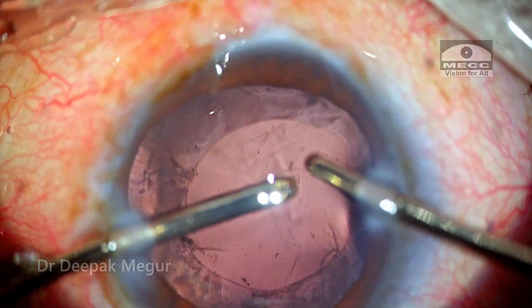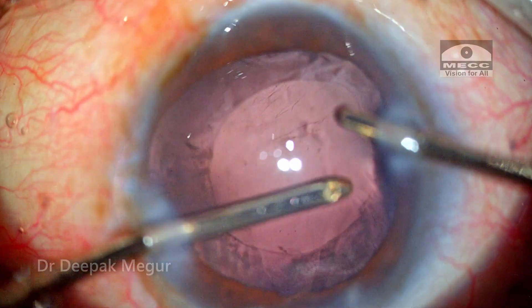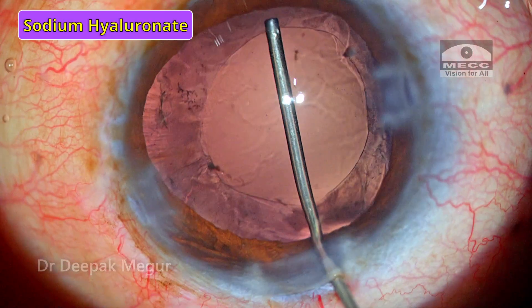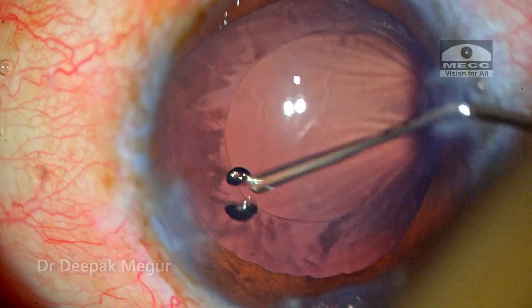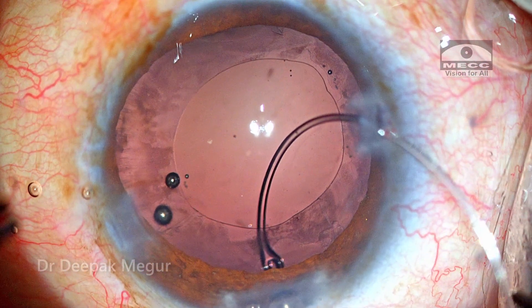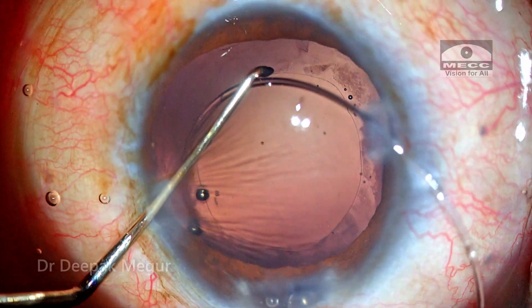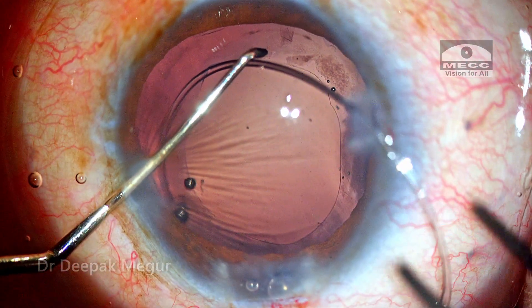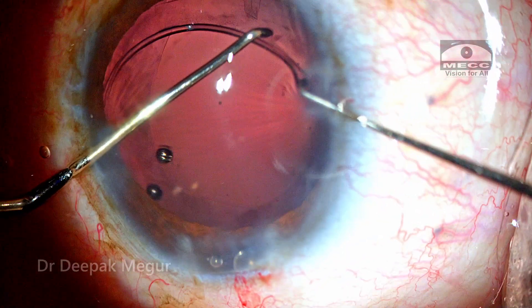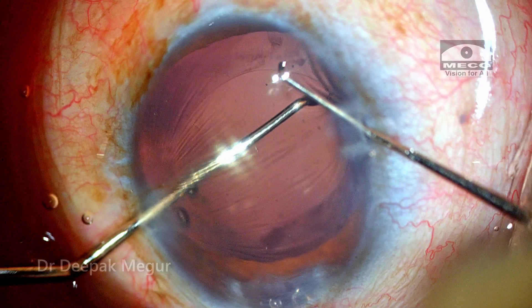I have still not inserted the CTR. Once all the cortex is aspirated, now is the time to implant the CTR. The bag is being formed with sodium hyaluronate. The CTR is gently threaded to the side port, which is my preferred way of inserting it — bimanually, using a Sinskey hook through my left hand to compress it so that as it is being threaded I don't induce any stress on the zonules. Care is ensured that the weak area is well supported, and finally the CTR goes into the bag.